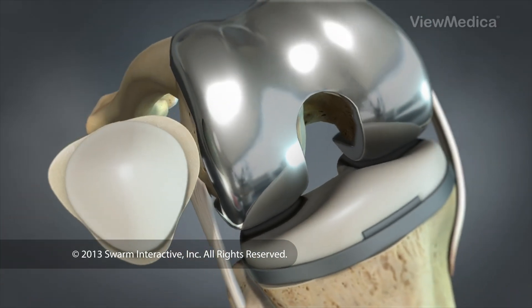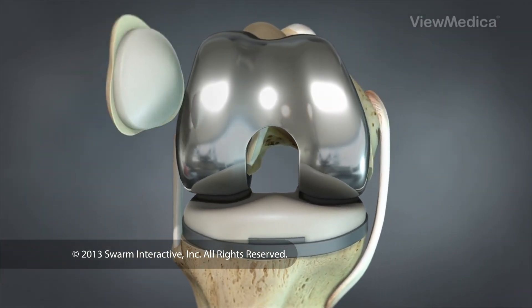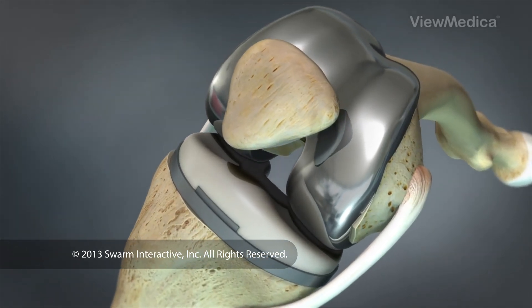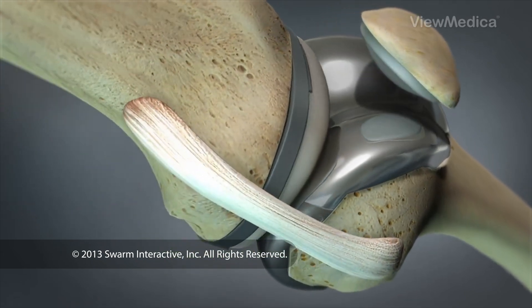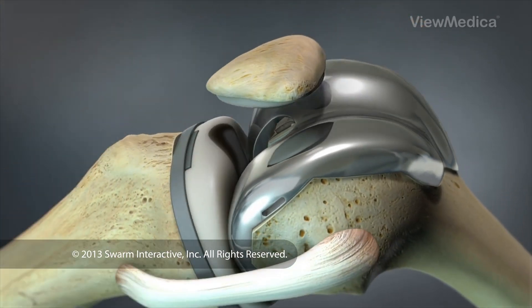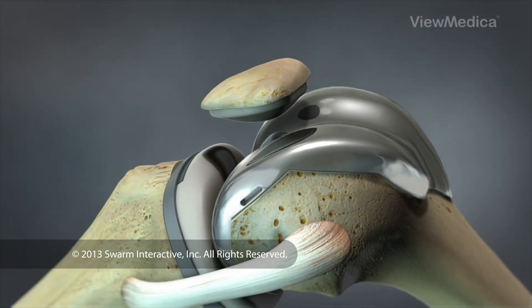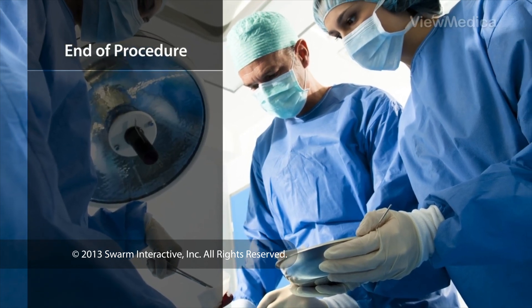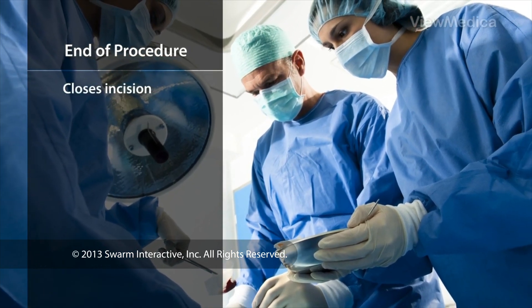When all of the components are in place, the surgeon tests them by guiding the knee through a range of movements, checking to make sure the knee flexes and extends with a fluid and natural motion. When the procedure is complete, the surgeon closes the incision and bandages the knee.